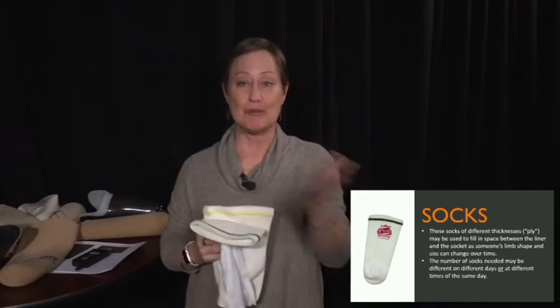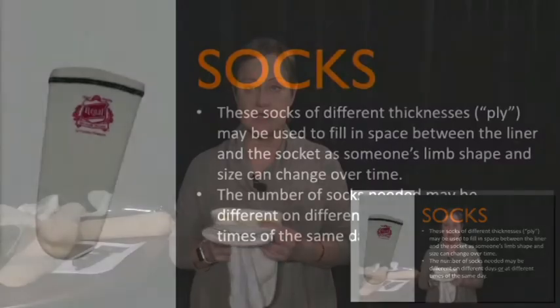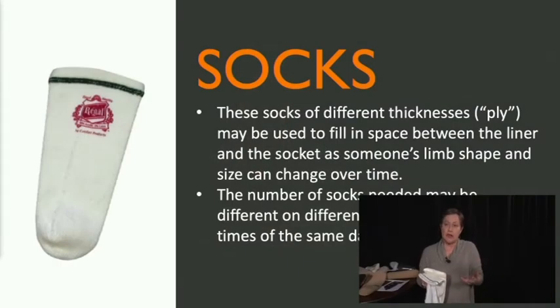Train your patients to bring a bag of all of this stuff to every therapy session, because especially early on, you're going to need to adjust socks. And as I've spent time teaching people how to roll the liner on their leg, I've spent a lot of time instructing in sock management. Our prosthetists are also teaching sock management. Don't think they're not.